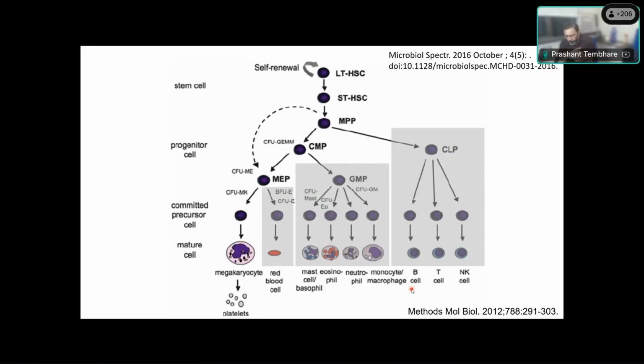Prashant, can I come in here? Yeah, please, Vanessa. There are two things. One is the basophil granule, as Prashant has explained. The other thing is basophils can degranulate fast, and basophil granules can also be lost during processing, as happens in a peripheral smear due to exposure to water. So both these things will reduce the basophil granularity, in addition to the explanation which Prashant has given.